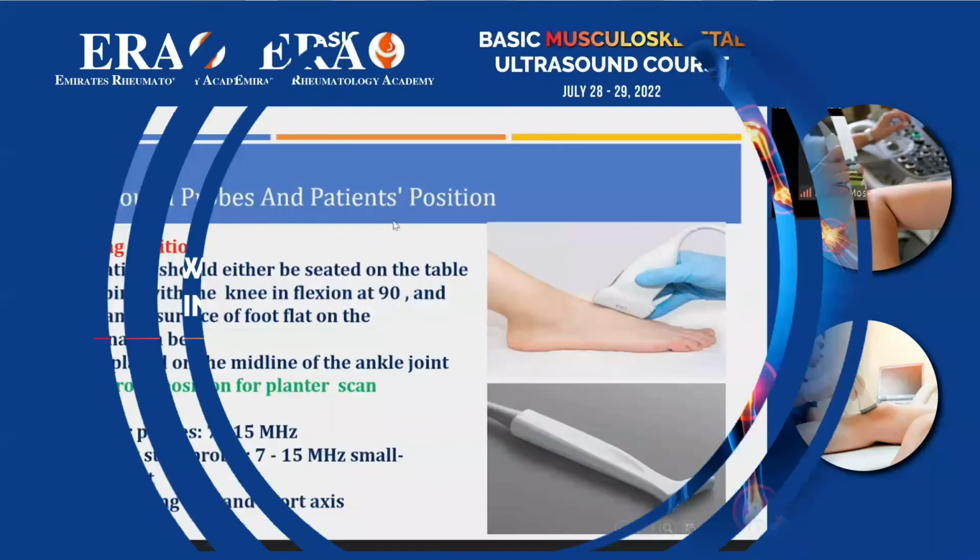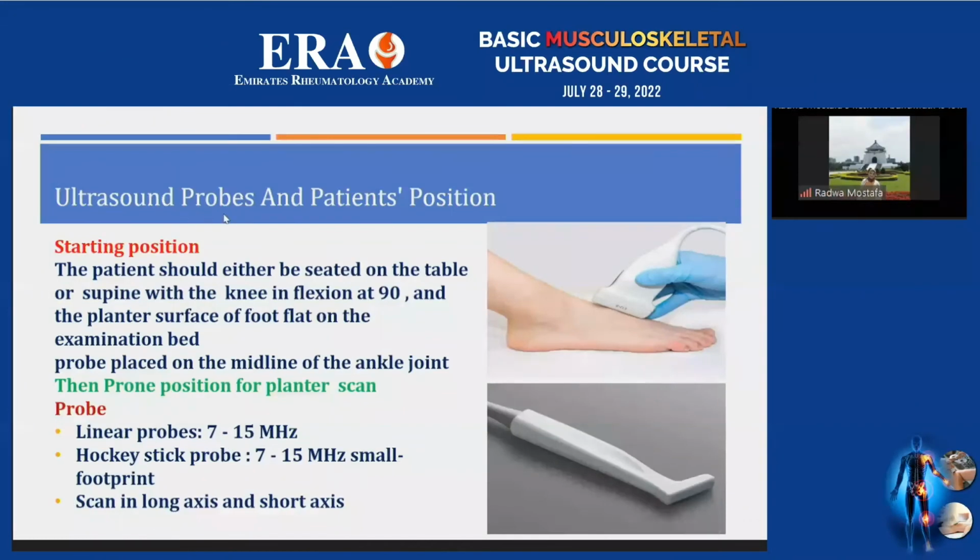Okay, we will start the scanning of the foot. The starting position is the same as the ankle. The patient is supine or seated with the knee flexed to 90 degrees, and the foot is flat on the examination table.